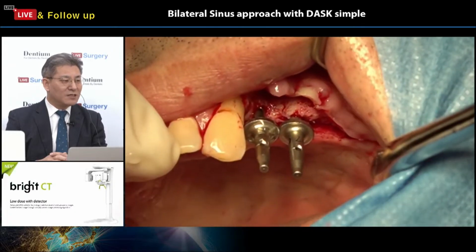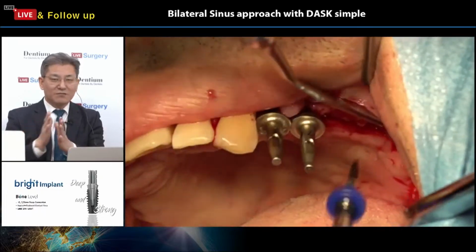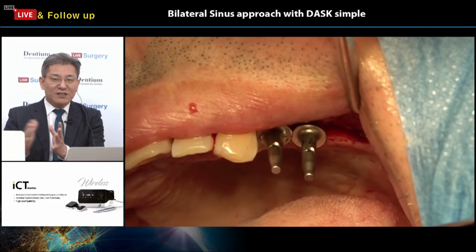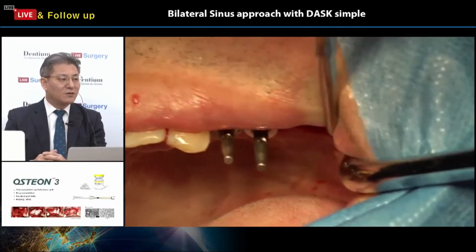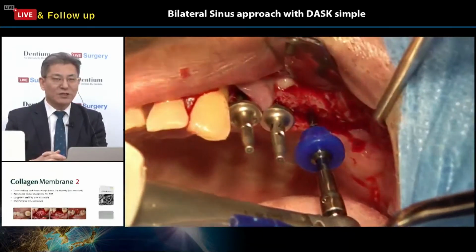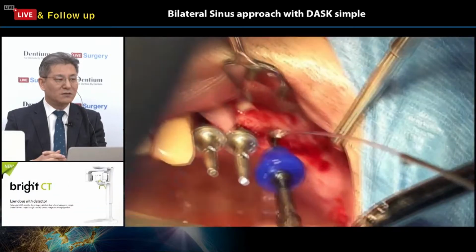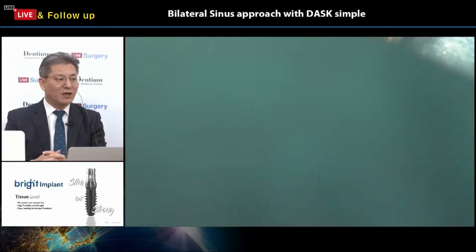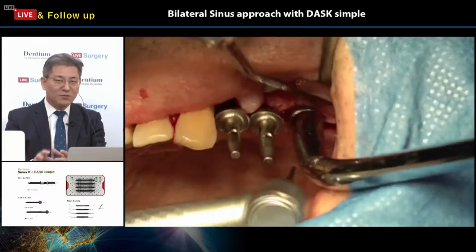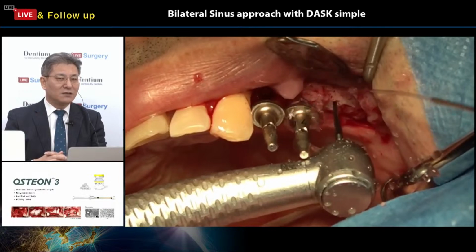Okay, another one. Can you see the 7 millimeter marking? The 7 means diameter, right? So this 7 is the mesiodistal width, very similar to the natural premolars. So the 7 millimeter indication pin means 2 premolars, the proper positions to be achieved. We can get the proper position even with freehand surgery, without a digital guide. However, the proper, accurate positioning is achieved when you use this blue spacer.